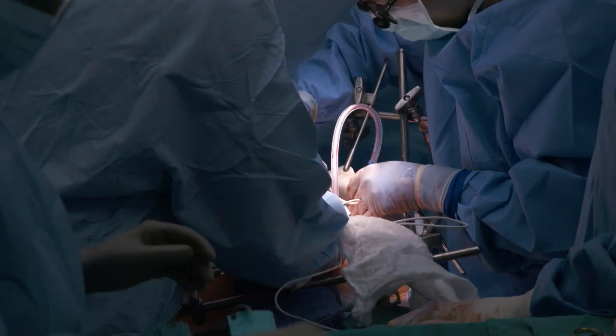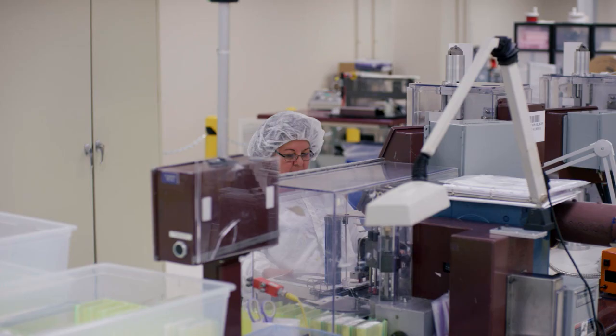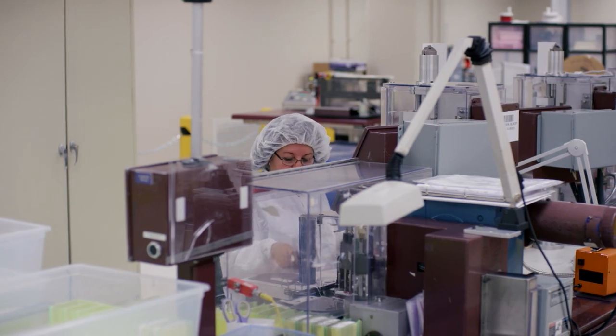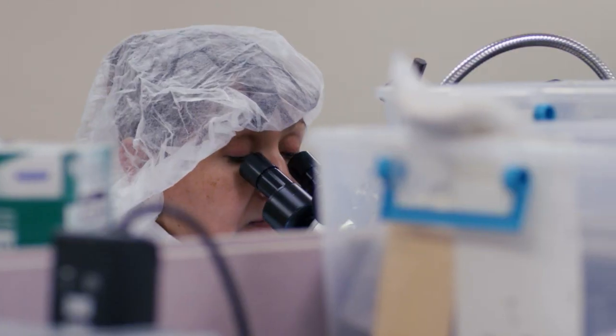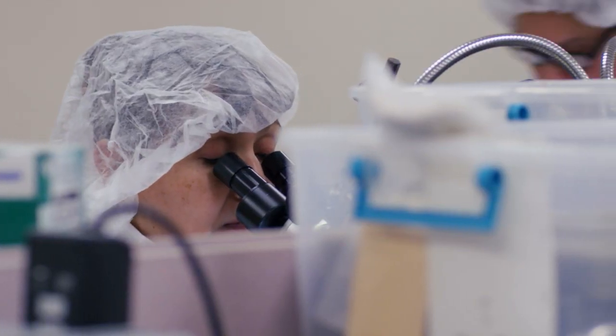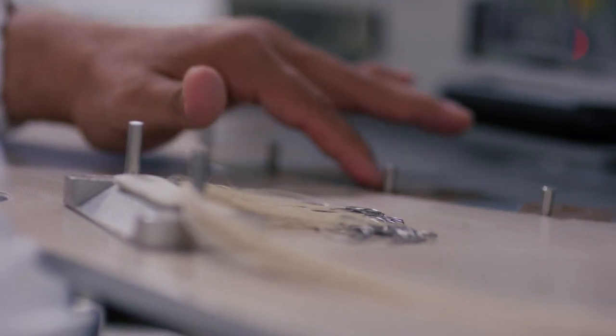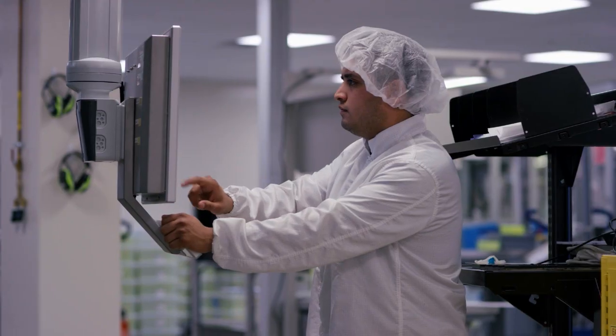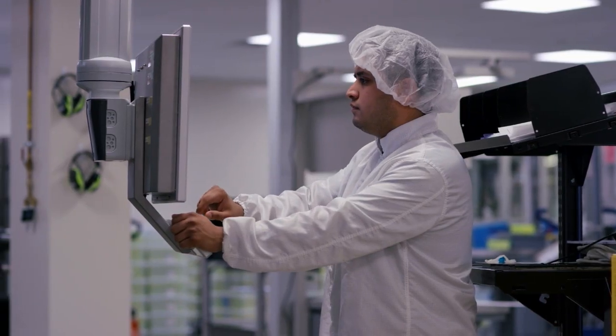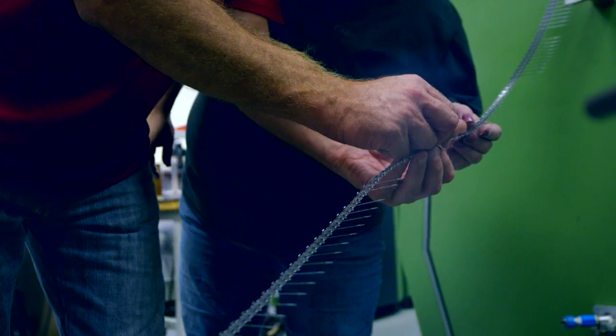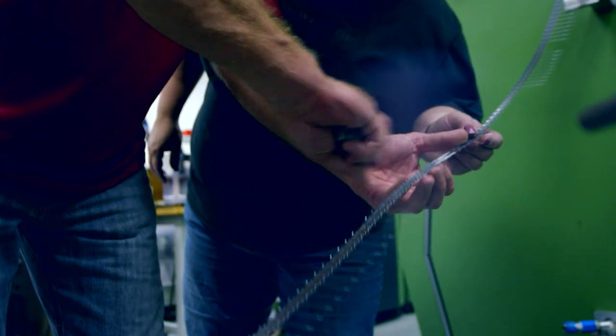It is a direct and passionate connection to these results that drive the people who make these Ethicon needles every day. You have family and they go through procedures. You don't know if they're using your needle or not, but sometime they're going to use it and it's good that you do your job, producing the best that you can.